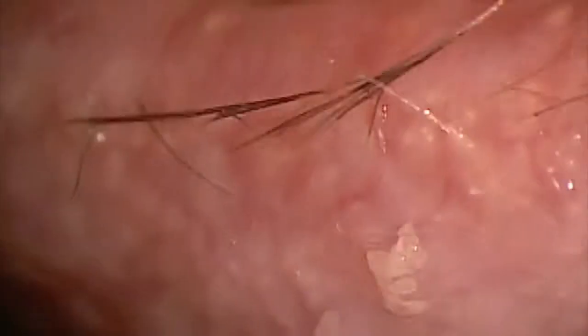You can now see the dramatic difference in the condition of the eyelid. By cleaning the lids with BlefX prior to cataract surgery, we should be able to reduce the incidence of endophthalmitis.